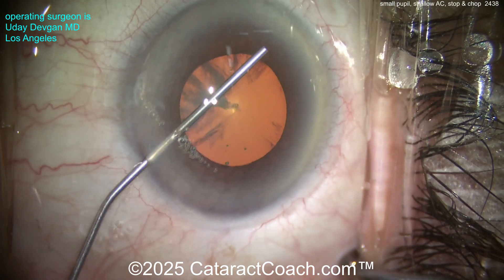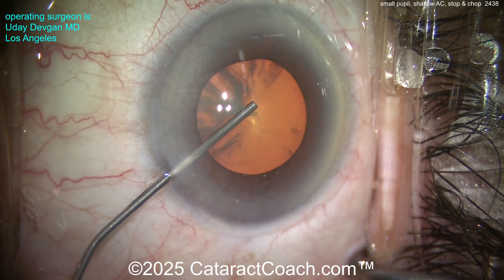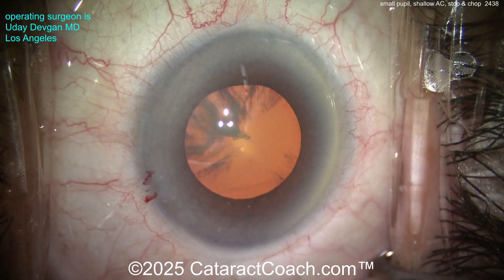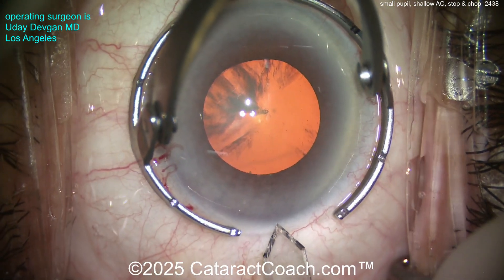This patient has a shallow AC — about two millimeters of AC depth, 1.8 — and the patient also has not the best pupil. This is after multiple rounds of all the dilating drops, including 10% phenylephrine. We also put intracameral lidocaine with epi, and still this is about all you get.